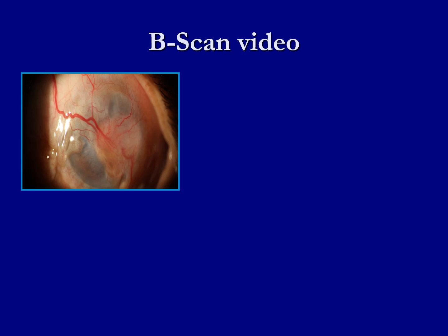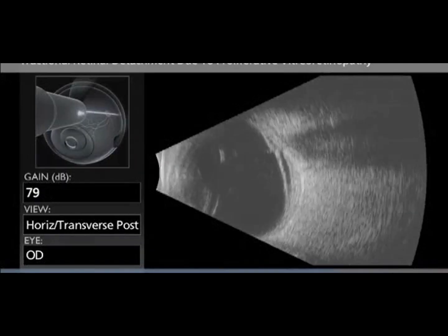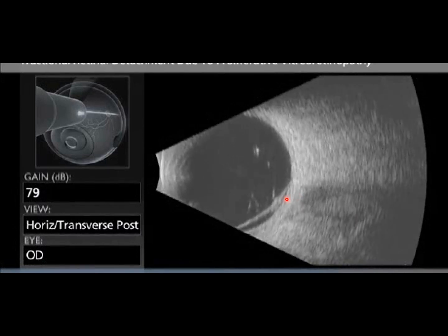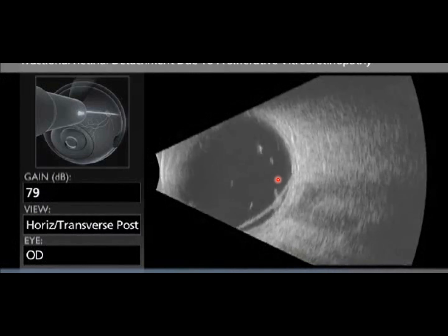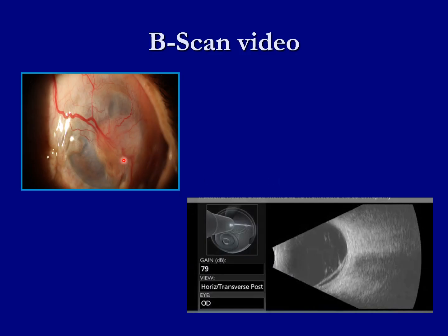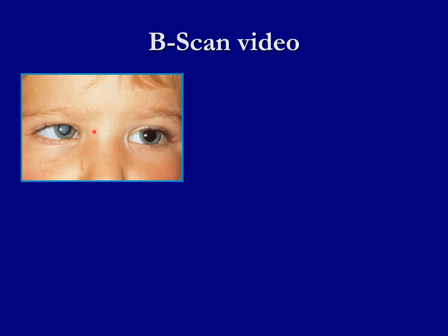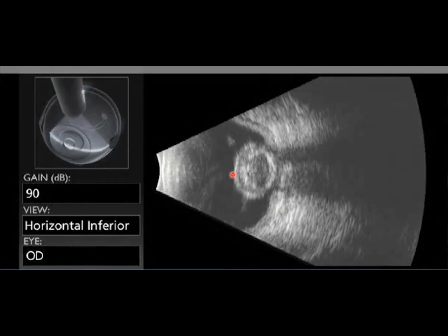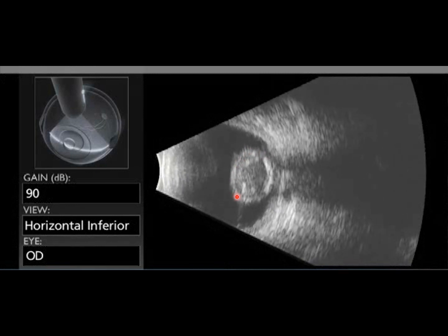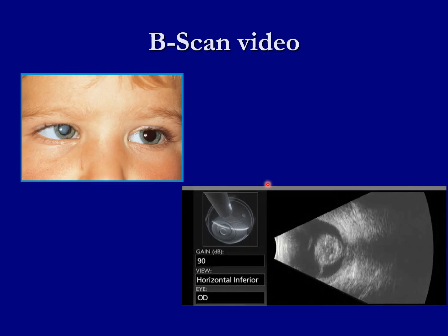Now look at this opaque cornea. Through the opaque cornea, I can see that the retina is detached. So it won't be any good to operate on this patient. We can think of removing the cornea and putting a new cornea in this patient, but because of the retinal detachment there, we are not going to do that. Look at the other patient — this patient has got a cataract. You can see the pupil is white, so we cannot see the retina. You do a B-scan and you can see there is a lesion, most probably a tumor at the back of the eye. So we cannot promise the patient that they will get vision back after the surgery.